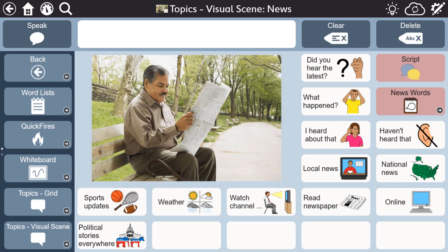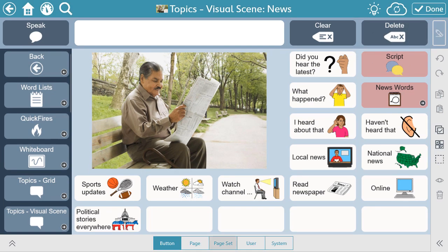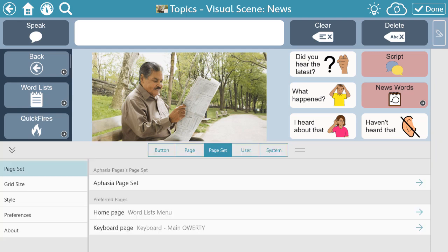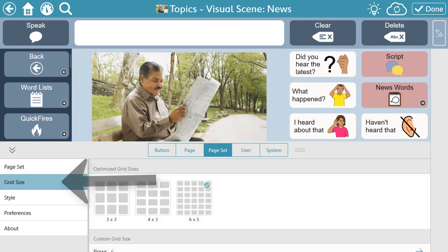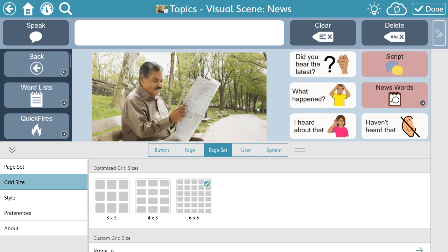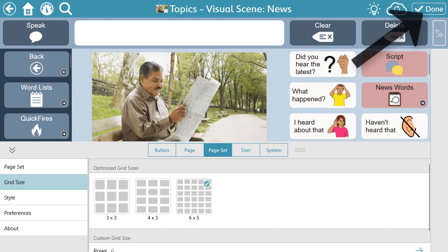Lastly, there are three grid sizes offered in the aphasia pages for Snap Core First. To access these grid sizes, select Edit, Page Set, then Grid Size. These sizes were included based on feedback from clinicians in the field and user testing. We know that people with aphasia do best with clean and simple designs, and these grid sizes provide the necessary tools and content without too much added complexity. Once you select the grid size that's right for you, you're ready to get started by selecting Done.